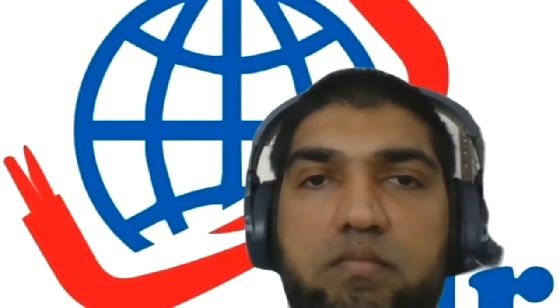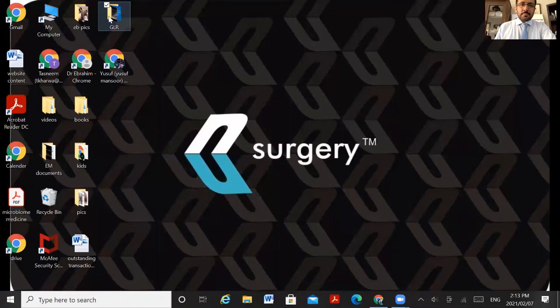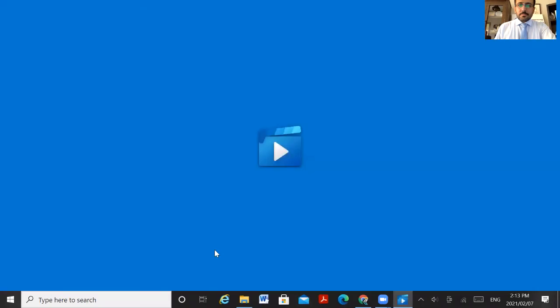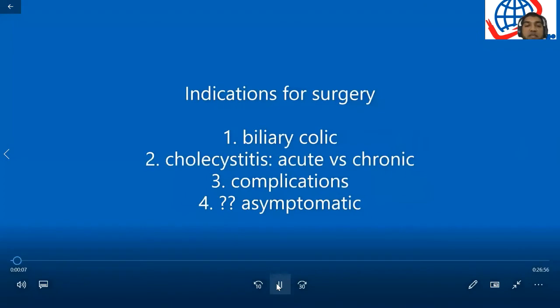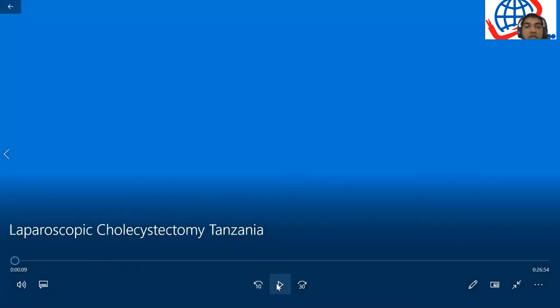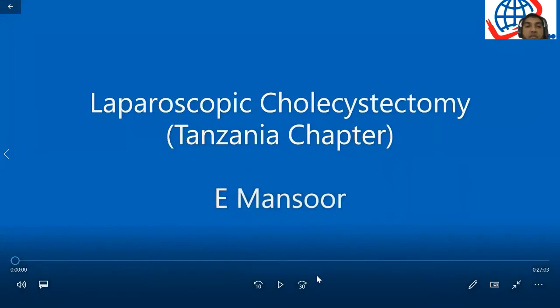Ibrahim, Brian, you want to share your slides? Yeah, I'm just getting in there. Okay, guys, so as I said, thanks again for this opportunity. We'll be discussing a few of the issues around laparoscopic cholecystectomy. Because this is a basic course, we'll try and stick to a lot of the principles and the techniques for all of you. And we hope that you will enjoy this lecture.